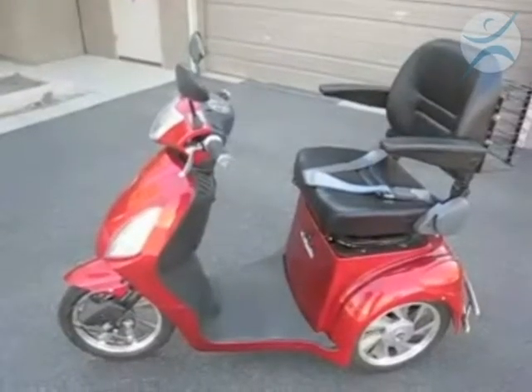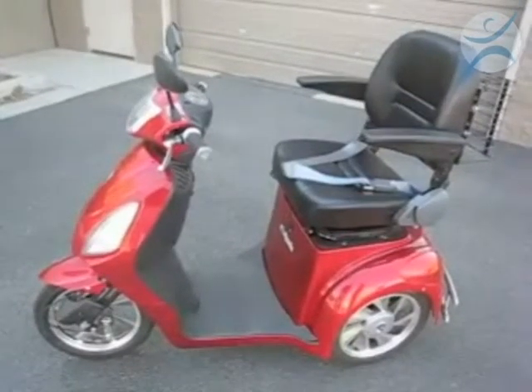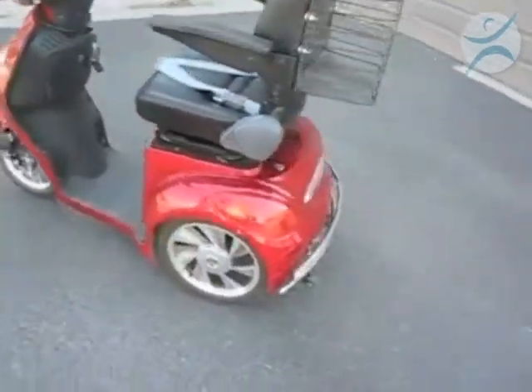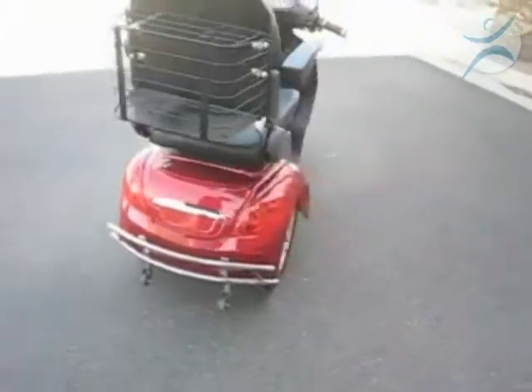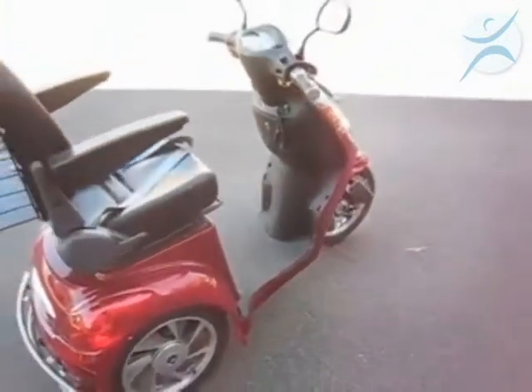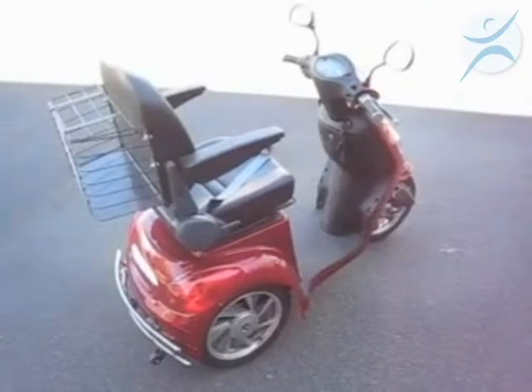I'm talking today about the EW36 E-Wheels Mobility Scooter. This is one of our top selling items. It's powered by a 500 watt transaxle motor, which makes it the most powerful, fastest mobility scooter on the market today. We've been selling this scooter for about three years, and we've had really great sales, great market acceptance, and we have a nice following of customers now.